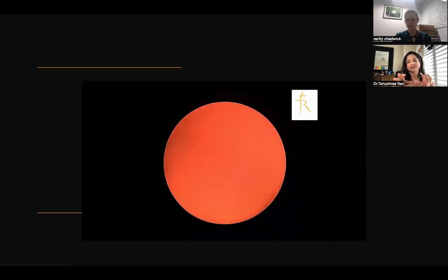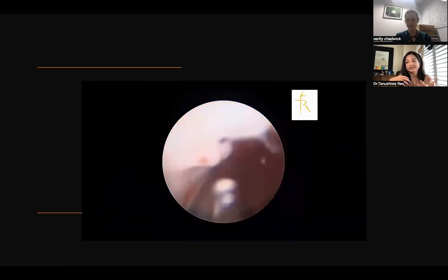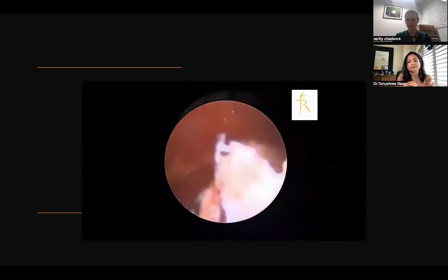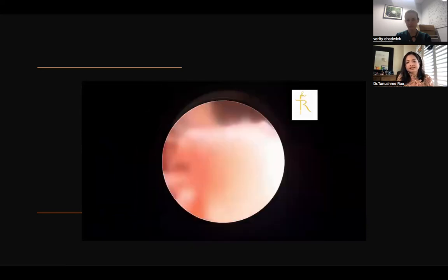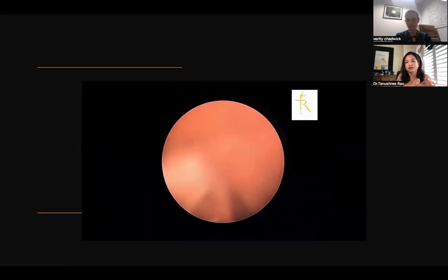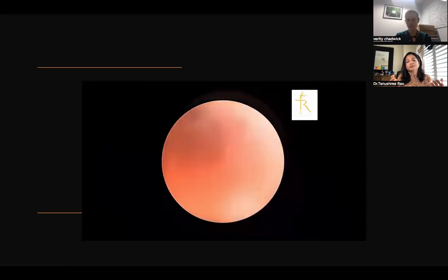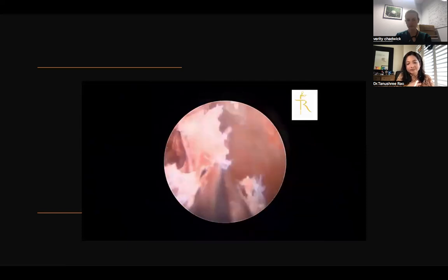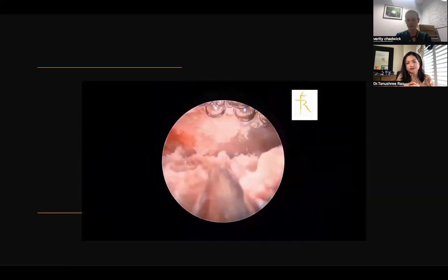So we did take some time, at least half an hour, 40 minutes. And it's very important in these kinds of procedures to be mindful of your fluid deficit. There are various containment systems that tell you exactly how much fluid is lost. The goal is that a lot of fluid shouldn't be retained in the woman herself, because then there's a risk of pulmonary edema and increased morbidity, okay?